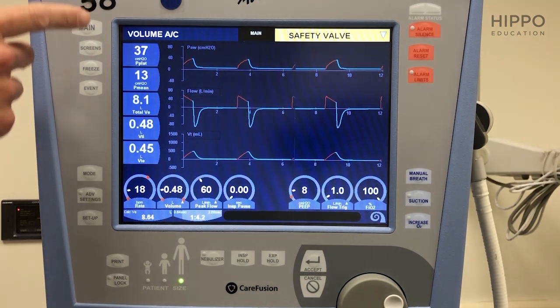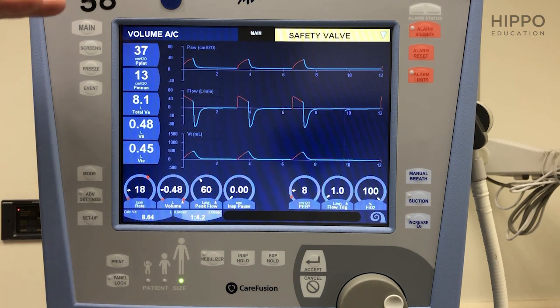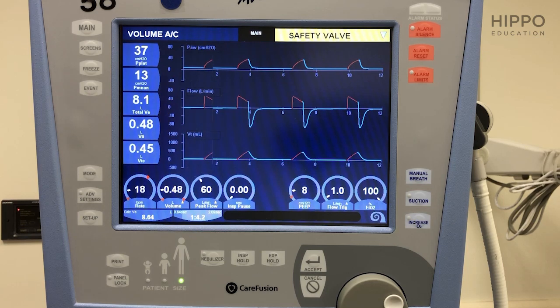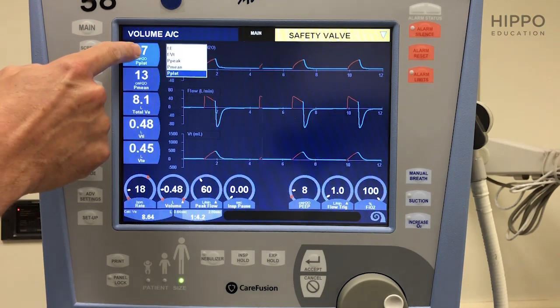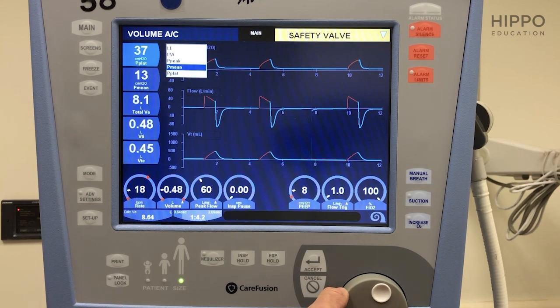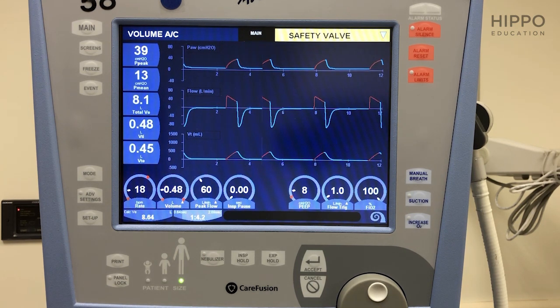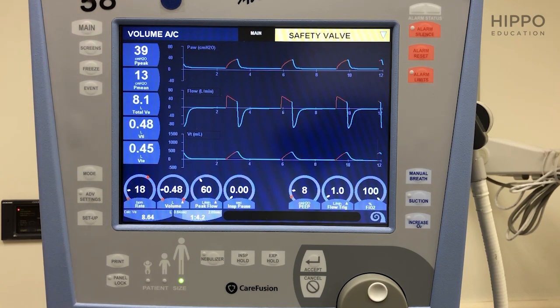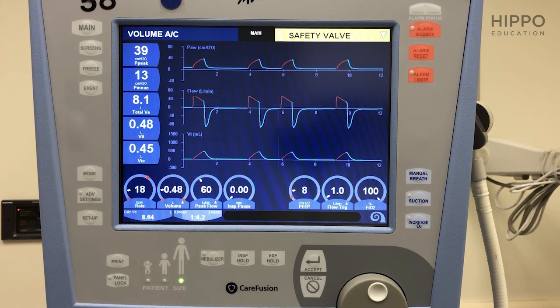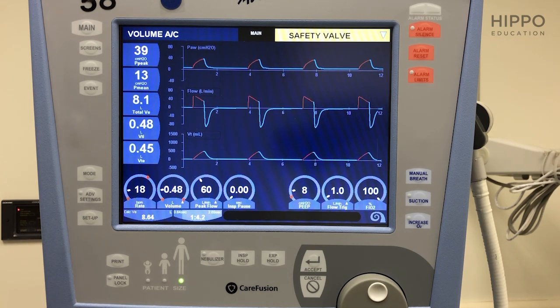The next thing — all these numbers here on the side — I want you to ignore almost all of them because they're just telling you what the machine is set at. The main one I want you to focus on is the peak pressure. This is where it'll alarm and tell you if the peak pressure is high — what is that number? We want a peak pressure of less than 35. The reason this machine isn't alarming right now is because the alarm limit is set at 40, so it's nice and quiet. That's the number you're going to be watching.